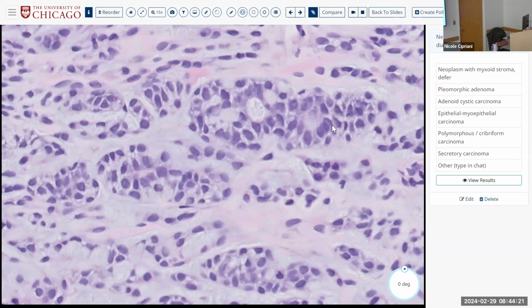But within the 3 conventional adenoid cystic grades, the tubular, the cribriform, and the solid, it's less clear how important those are for actual clinical behavior, because all adenoid cystics, even within those 3 conventional grades, have lots of PNI, and have the potential to metastasize even aside from being fully high-grade transformed.